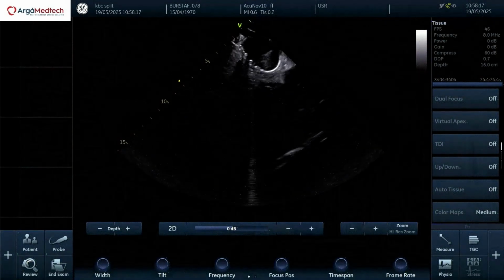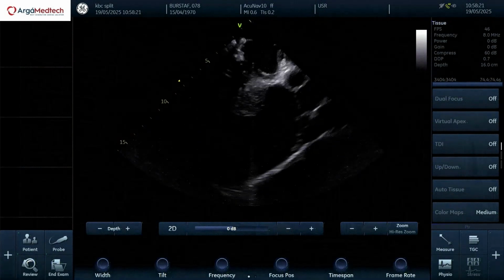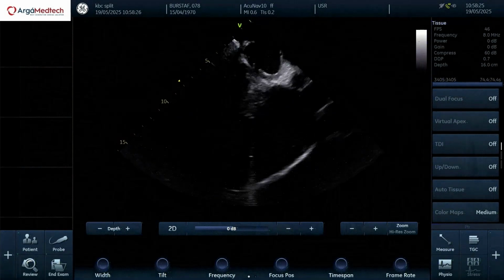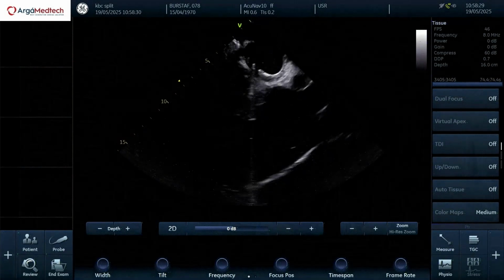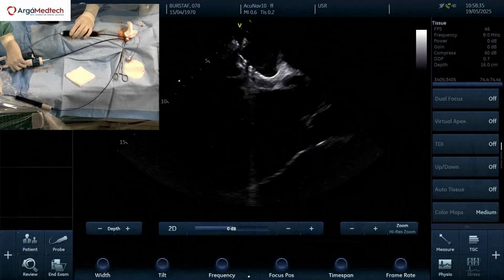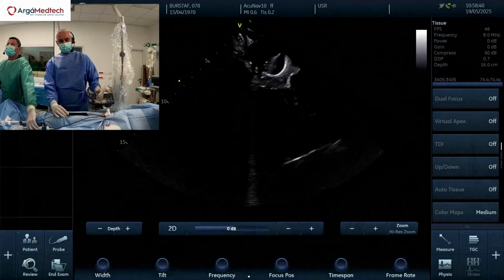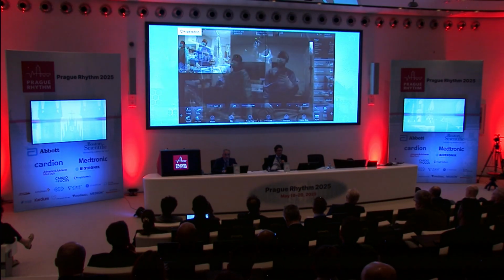Yeah, I'm there. You see, so if I want to address, and this is very important, thank you for asking, not too many multipolar platforms can really address those pouches, because pouches are always there. If you go septal, there is always a pouch. And in 30%, there's an extremely deep pouch. So now we're going to do more, just to address those pouches and maybe to address more this tricuspid segment. Thank you for the question. So you see how fast you can reconfigure our setting.